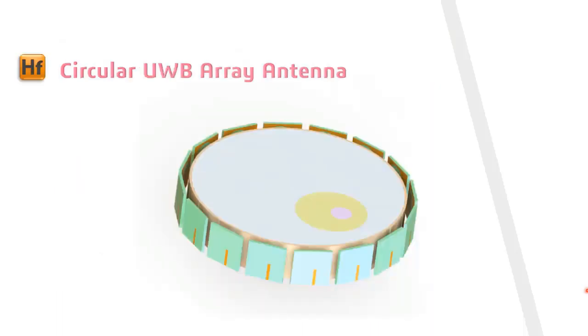And now I would like to move on to the other example that presents a circular ultra-wideband array antenna. Array antennas are widely used for breast cancer detection. An antenna array is a set of multiple connected antennas which work together as a single antenna.